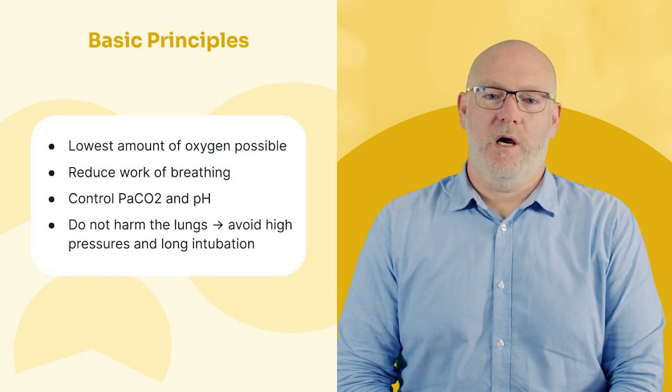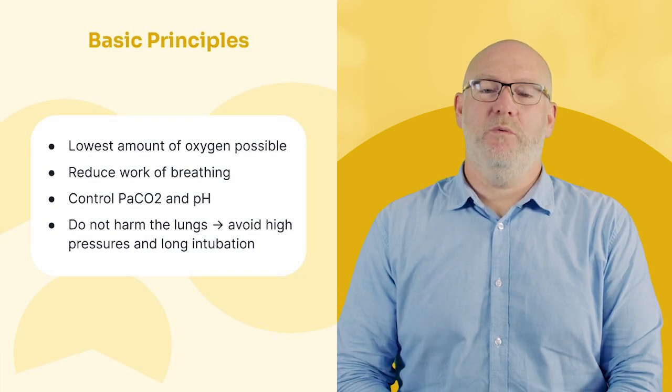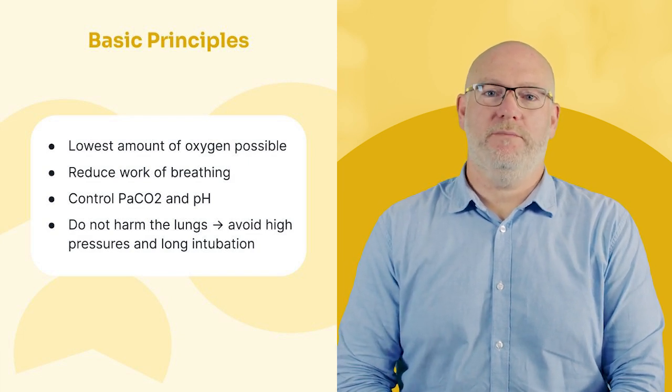So we want to avoid high pressures in ventilation. And as soon as we don't need that person to be ventilated anymore, we want to wake them up and get that breathing tube out.